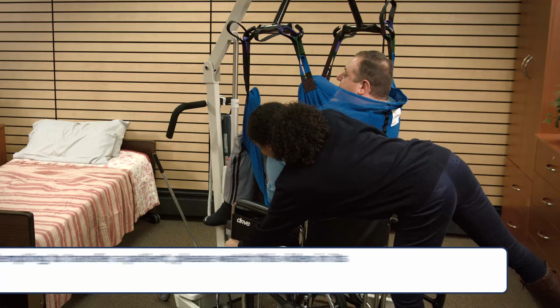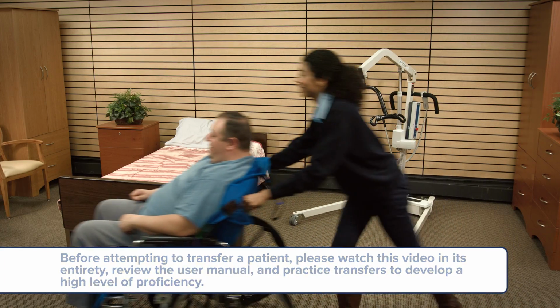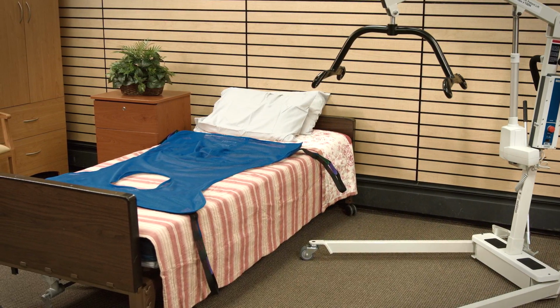Keep your back straight and in a neutral alignment. Do not twist your back when lifting. Keep your center of gravity stable and low, and use your leg muscles. Let's begin with how to operate the electric patient lift.